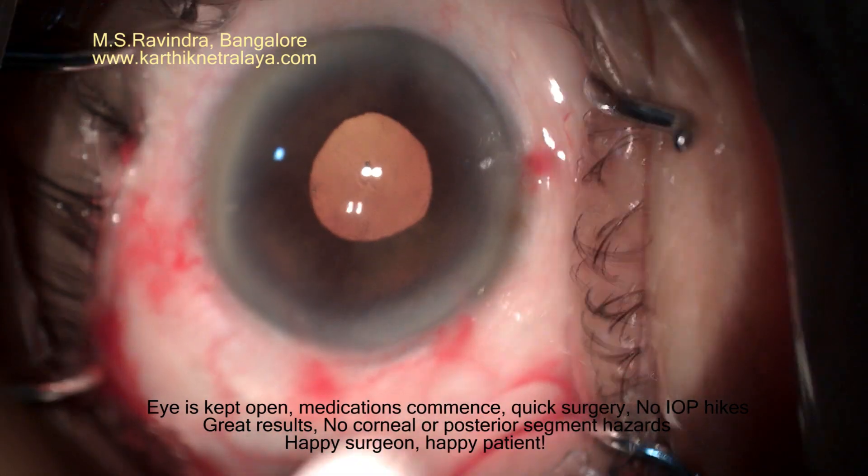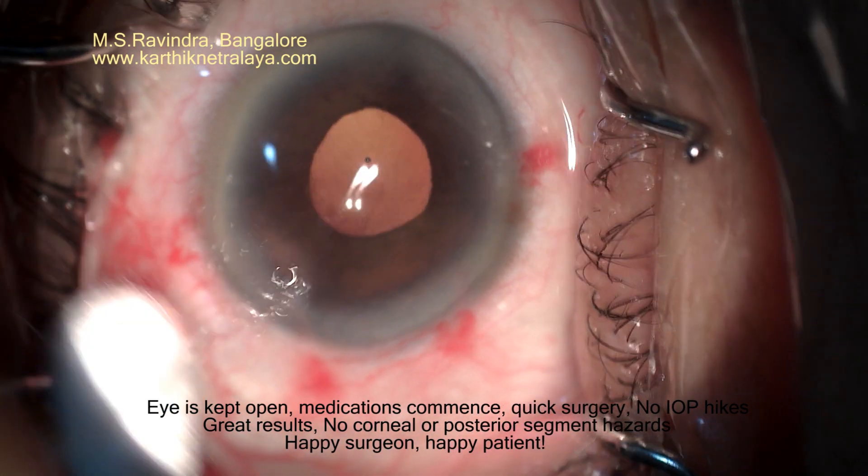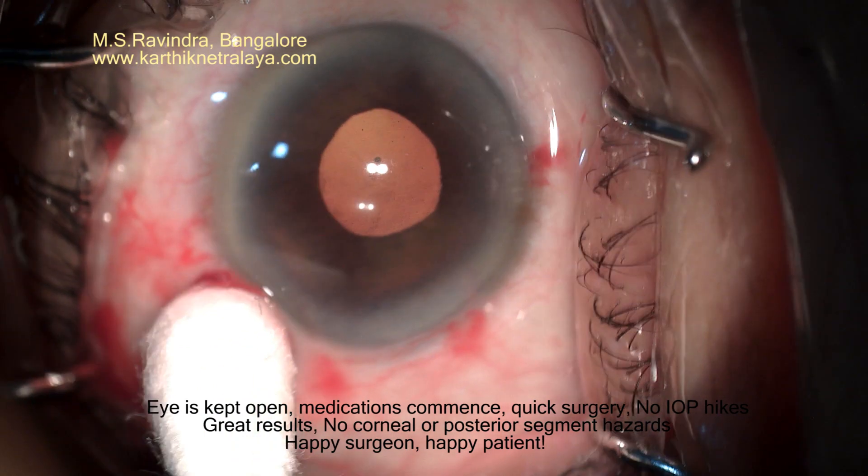The ports are intact. There is no need to hydrate, there is no need to bandage, so that the medications can start immediately.